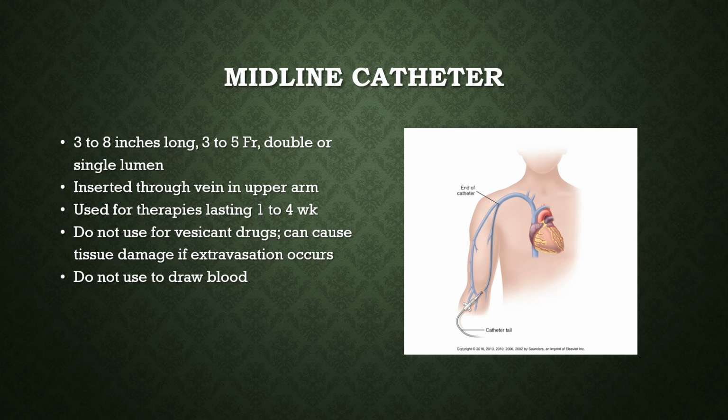It can stay in 1 to 4 weeks, and you can see in the picture that it doesn't go quite to the distance that a PICC line does, but it goes almost up to the subclavian, or up to about the subclavian, but not down into the vena cava.